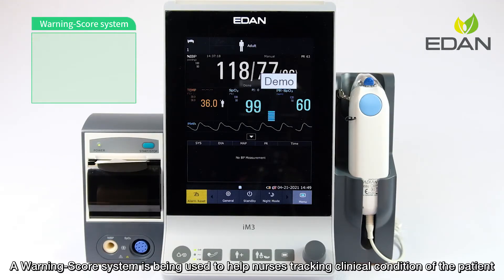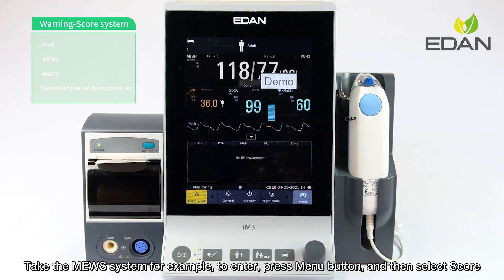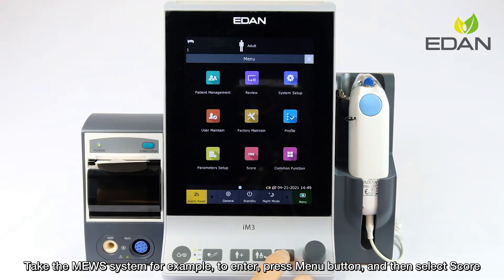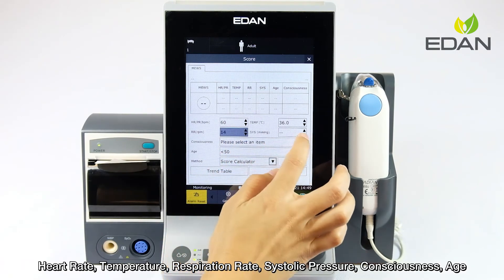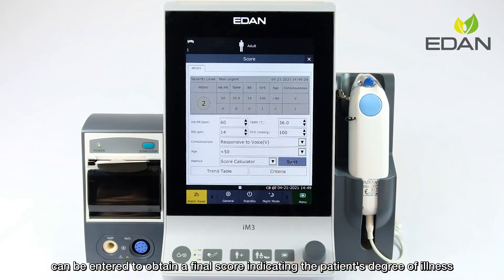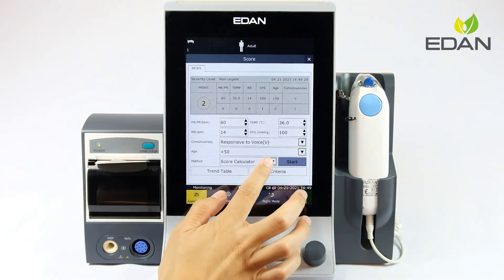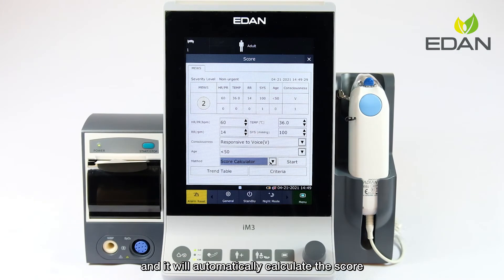A score system is used to help nurses track the clinical condition of patients and quickly determine their degree of illness. To enter the score system, press the menu button and select score. Heart rate, temperature, respiration rate, systolic pressure, consciousness, and age can be entered to obtain a final score indicating the patient's degree of illness. In auto score mode, some values can be acquired from monitoring data directly and the score will be calculated automatically. Click the trend table to review results.